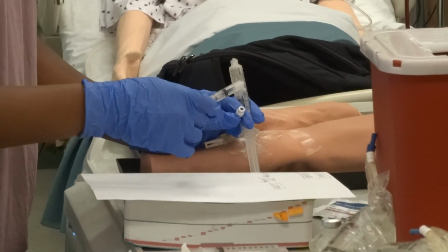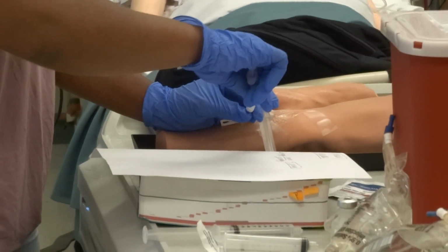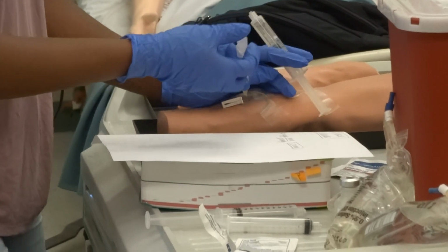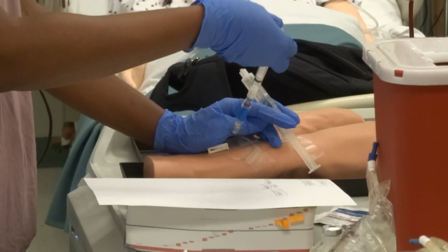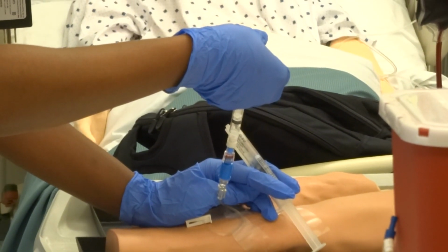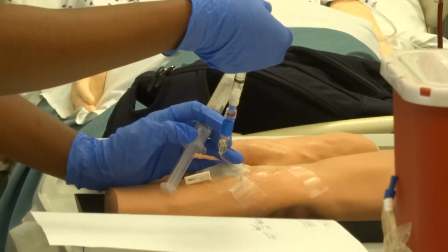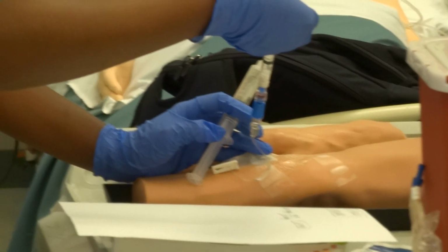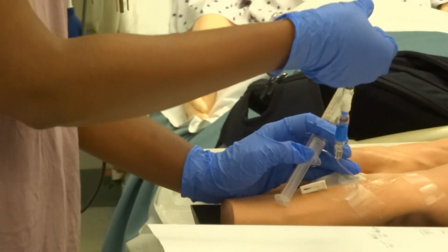So, all right, I'm going to attach the Lasix. And when I push it, I'm pushing over 2 minutes, right? And some people use the start-stop method, so you push a little bit over each time. You don't really have to do that.